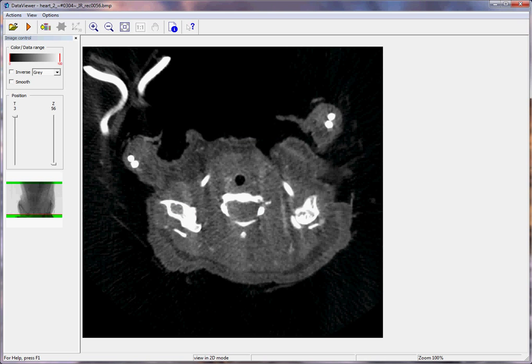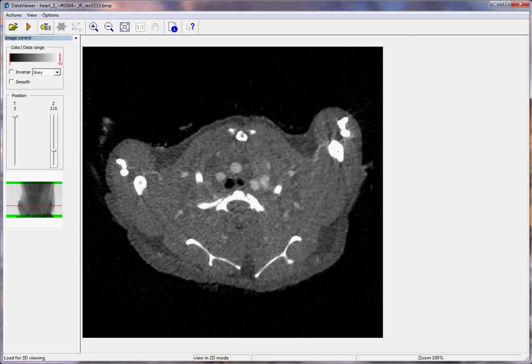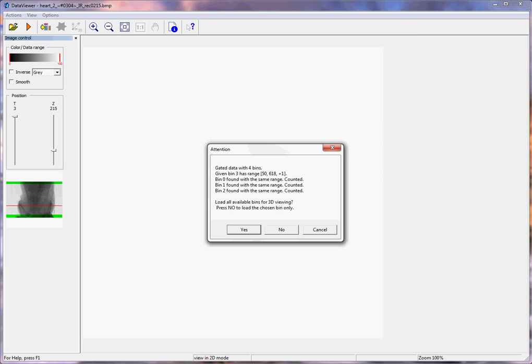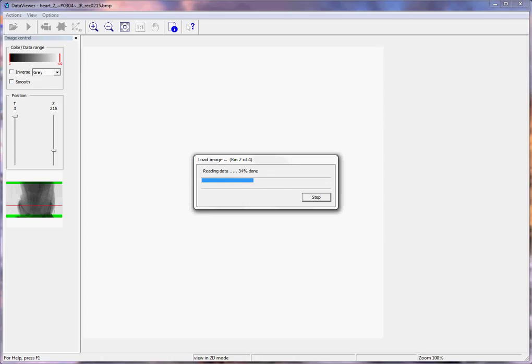Now with the data set open, click on this button here for loading for 3D viewing. Then click Yes, and the four data sets will load in one after the other.